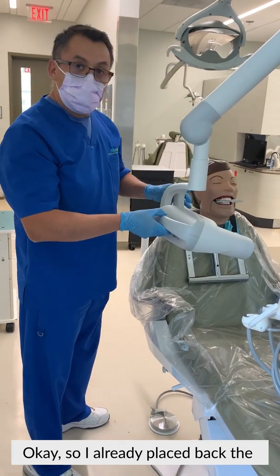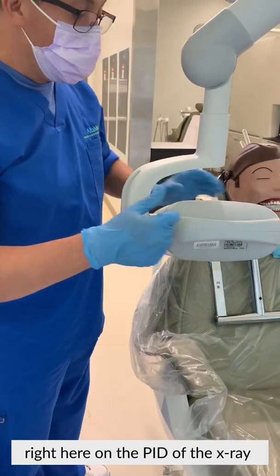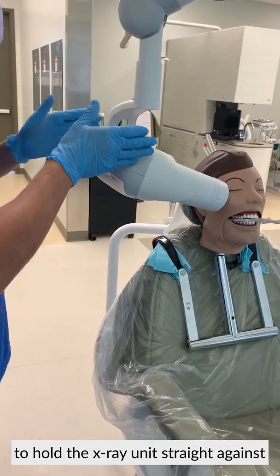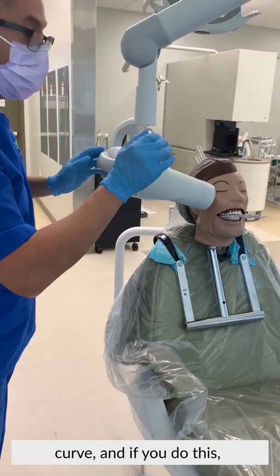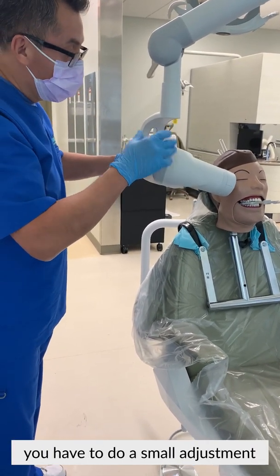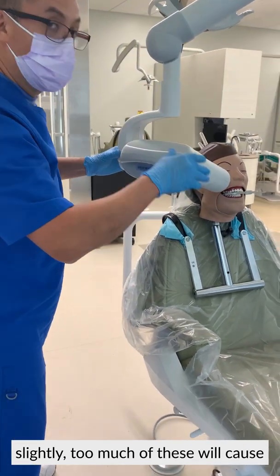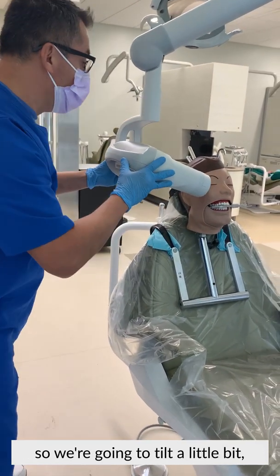Okay, so I already placed back the film inside the patient's mouth. As a recap, we have 20 degrees set right here on the PID or the X-ray machine, the X-ray unit. Now, step number one, you don't want to hold the X-ray straight against the teeth like that because our teeth curve. And if you do this, you're gonna get overlapping. So you have to do small adjustment with what's called a horizontal angulation. That means you're gonna tilt the PID slightly. Too much of this would cause overlapping. Not enough would cause overlapping as well. So we're gonna tilt a little bit.